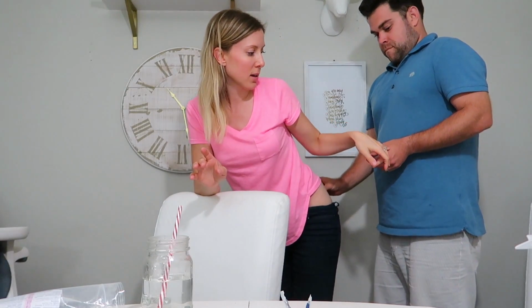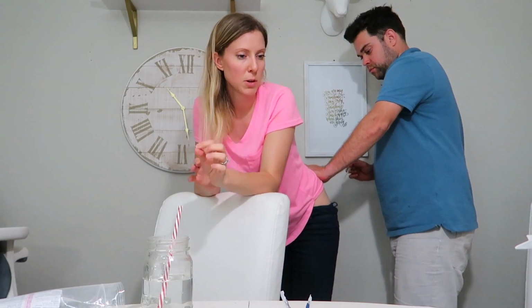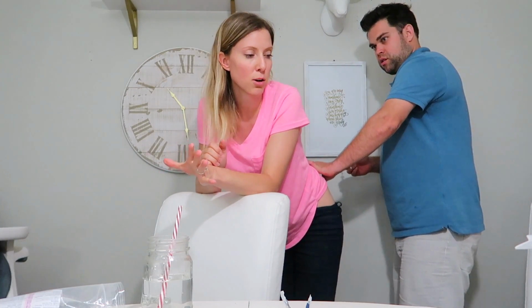Okay, so I want you to grab, do the whole finger and thumb thing. So you have to do it with that hand. Yep. And then I want you to hold on. And when you're pushing it in, you can either hold on to the skin or let go of the skin. And then jiggle it. Okay, but you're pinching, that hurts. I'm trying to make more pain than the needle. That is the trick. If you make more pain on my skin, then I don't feel the needle as much. It almost distracts your nerves.